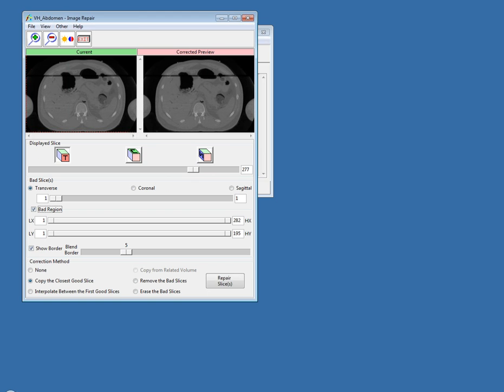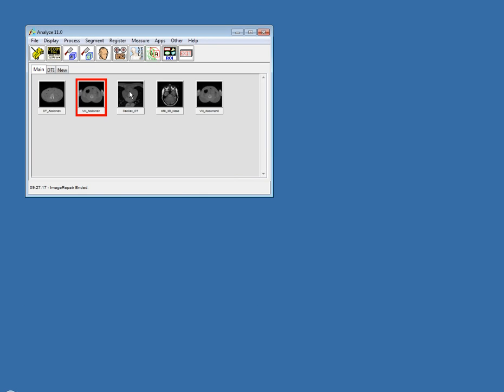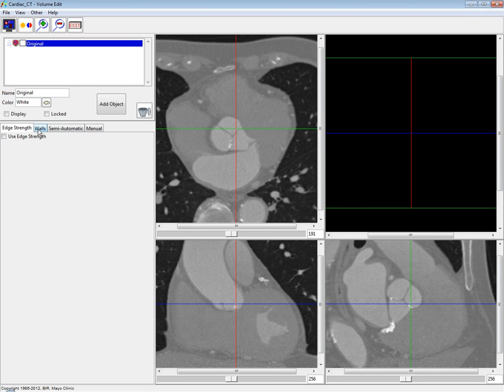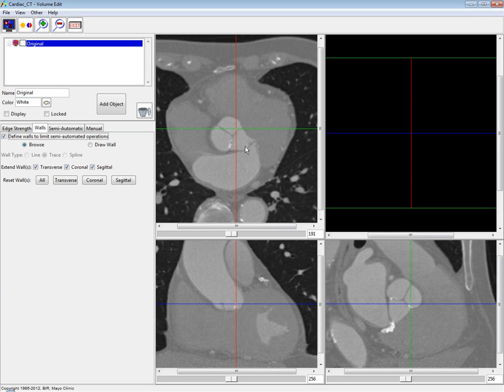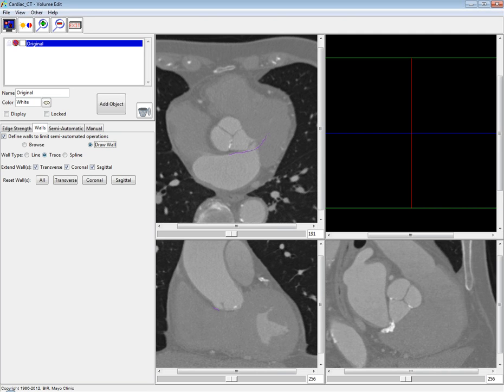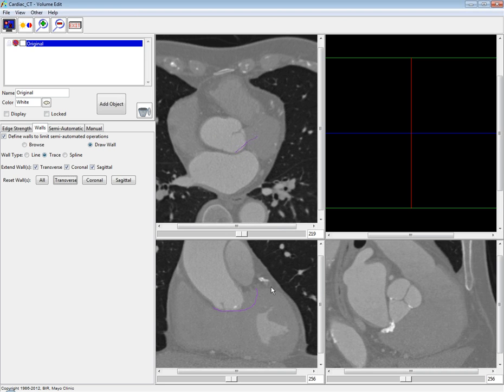The next question is about Volume Edit: can you define walls in multiple orientations or just a single orientation? You can actually define walls in all three orientations. For instance, I could draw a wall in my transverse orientation and also draw a wall in my coronal orientation. Another question is whether you can define more than two walls in the same orientation. You cannot define two walls on the same slice in one orientation — you would have to move to another slice and then define your next wall.